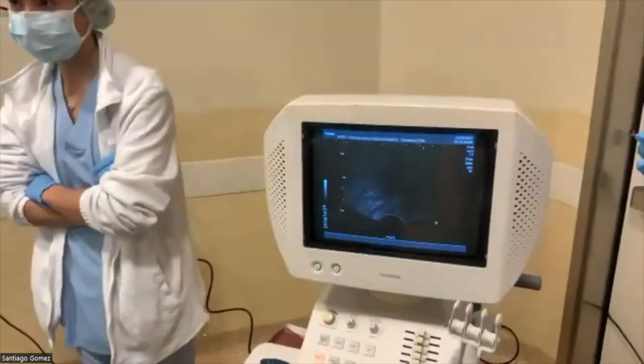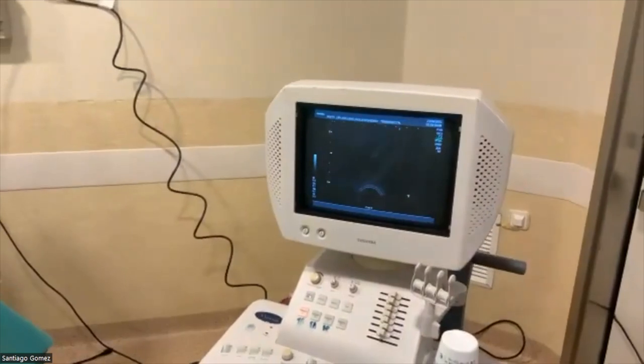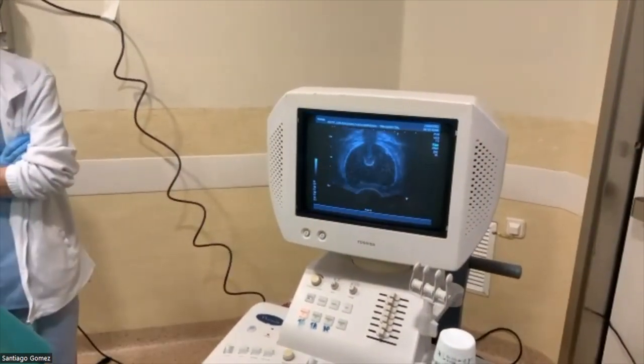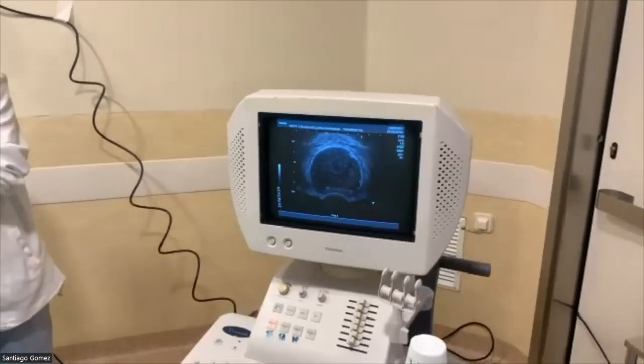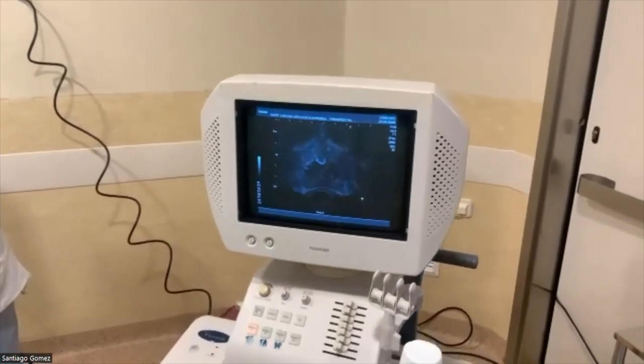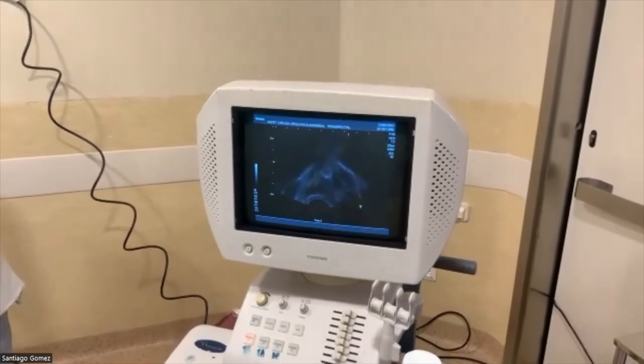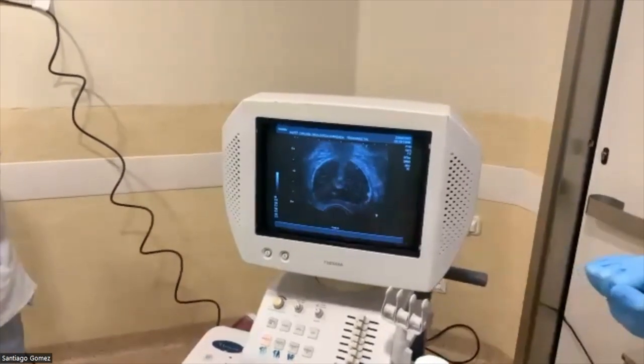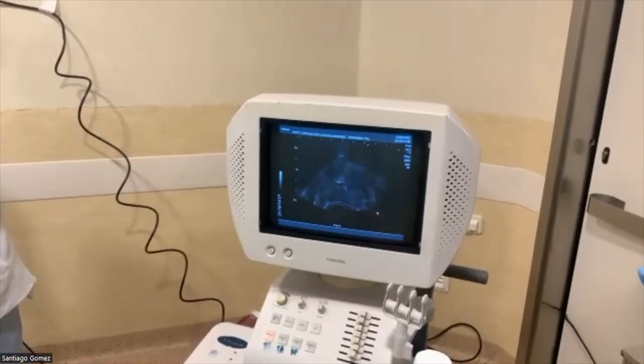So what I'm doing is I'm introducing the ultrasound. You see? Now you can see the quality of the anatomical enucleation. You see that? So this is transrectal ultrasound. I have the scope in the fossa here. And you can see that we did a nice job.